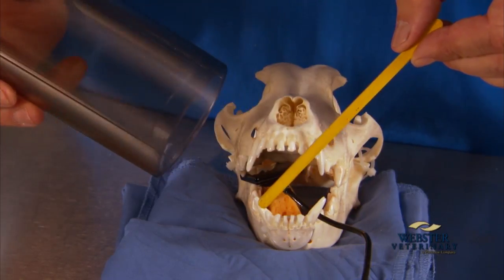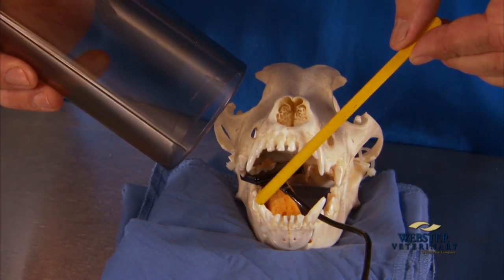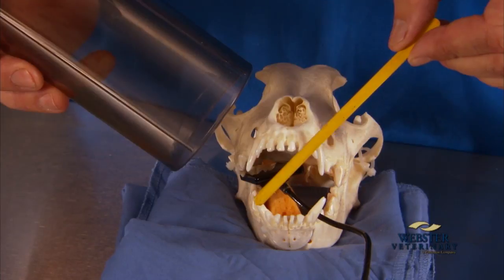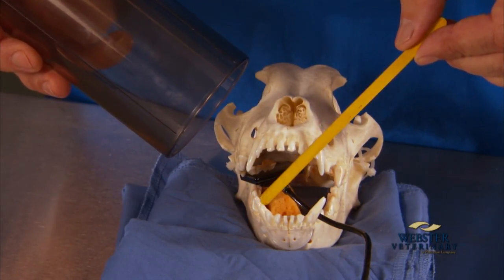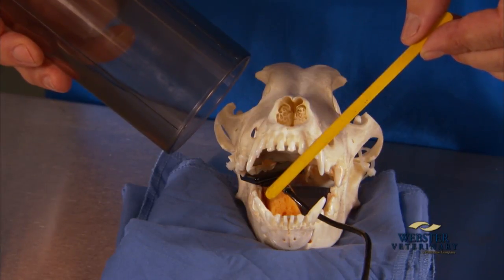or may be placed in a bisecting angle technique and moved 10 to 20 degrees caudally in order to separate the roots and get an image that can diagnose pathology on these roots.